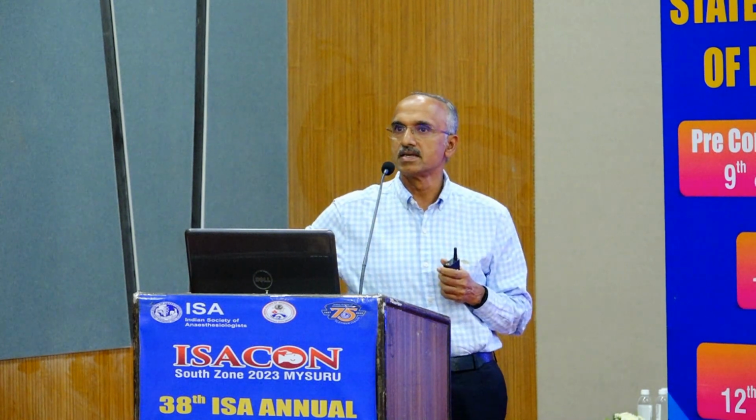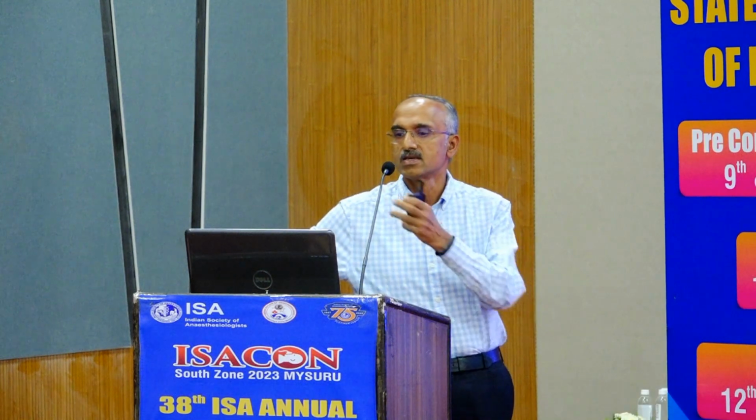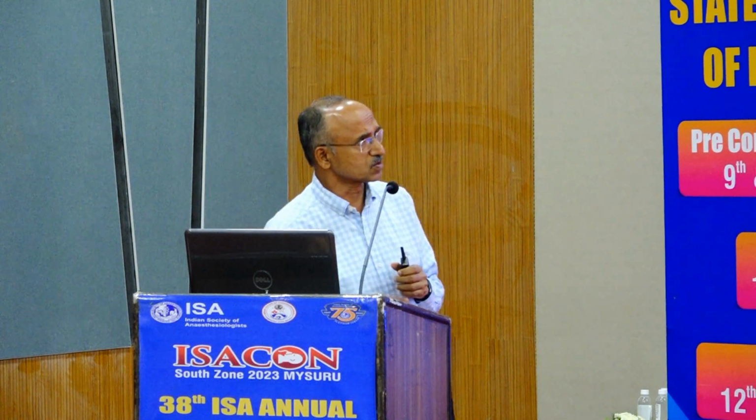So don't underestimate. These are obvious. And one thing is, when we talk of Scalars, it is obvious that the patient is already on a ventilator, right? Scalars are also possible on a non-invasive ventilator, but most of the studies have been done on intubated patients with mechanical ventilation, and the same applies for non-invasive ventilation also.